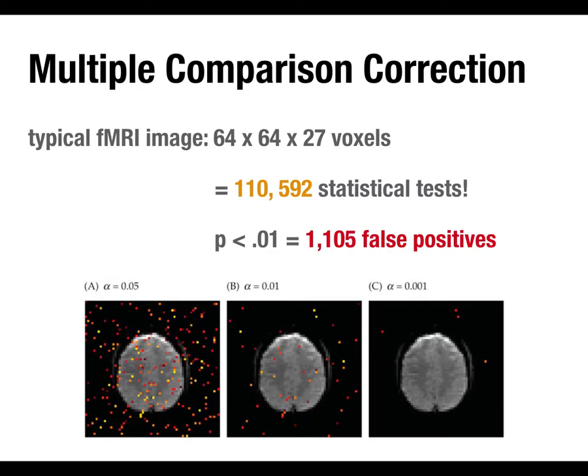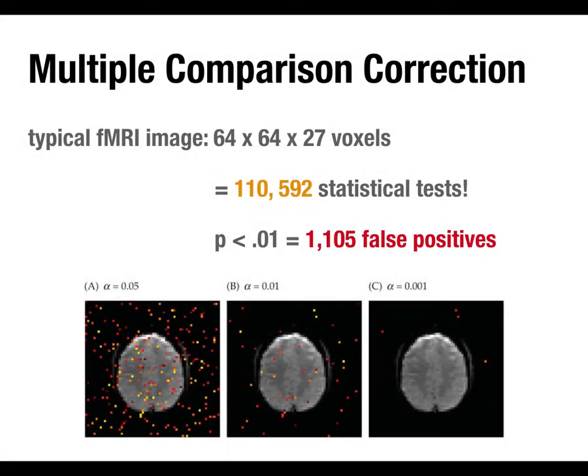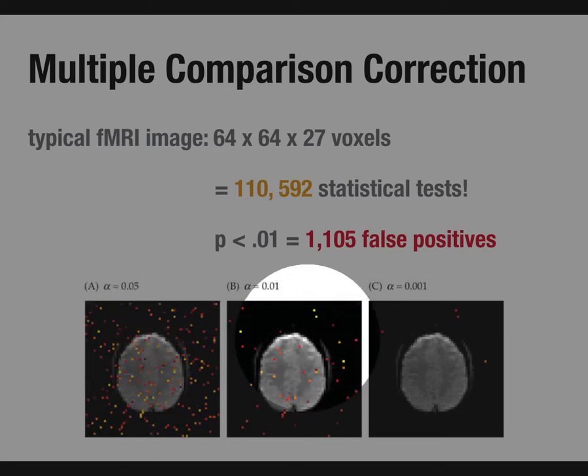It's just random chance. And that's what you're seeing in this bottom image, just the same brain map in a case where there was no actual activation. And they analyzed it using some model of what they thought the activation could be. And at p of 0.05, you get noise all over the place, including outside the brain, which should make you very suspicious unless you believe in ESP.